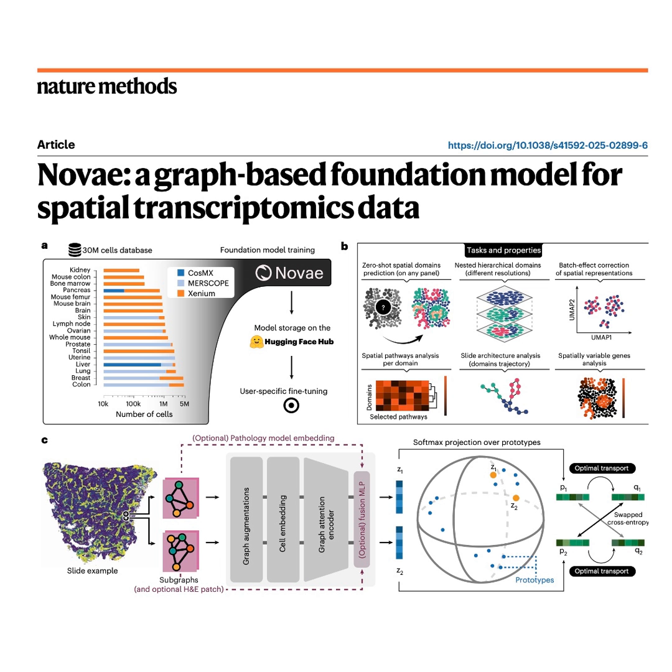Which brings us to the flexibility problem. We learned Novae created these tiny foundational prototypes. But if I'm a pathologist looking at a whole tissue section, I'm interested in the big, coarse-grained structures. So how does Novae translate those tiny prototypes into the major domains we actually study? That's the beautiful design choice that really unlocks Novae's speed. The prototypes are treated as the leaves of a hierarchical tree.